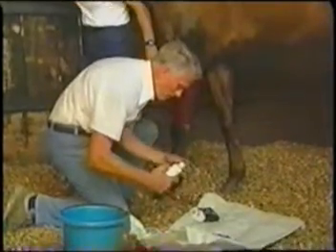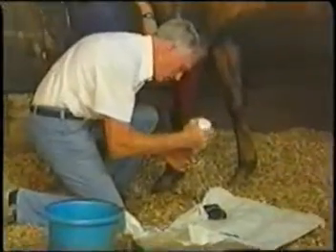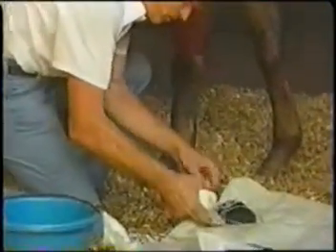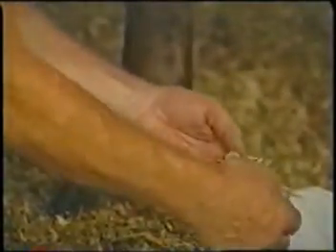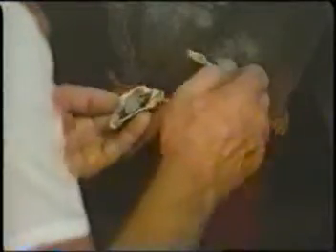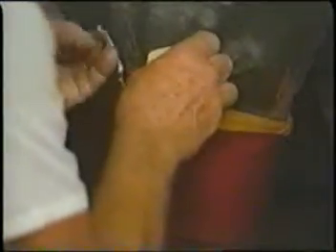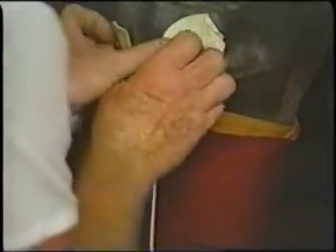Now that the chamois is on, I am putting the contact lotion onto the pads, onto the little electric pads. You can see the contact lotion there. Now the pads are placed on the muscles in front. There are a total of 4 pads. These are placed on the front muscles and held in place with another bandage.